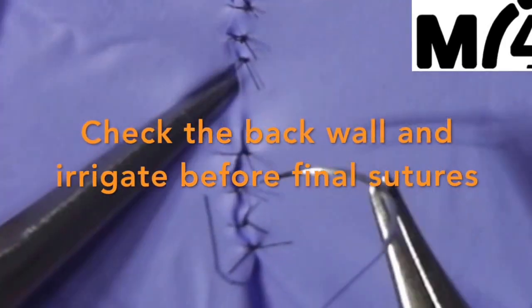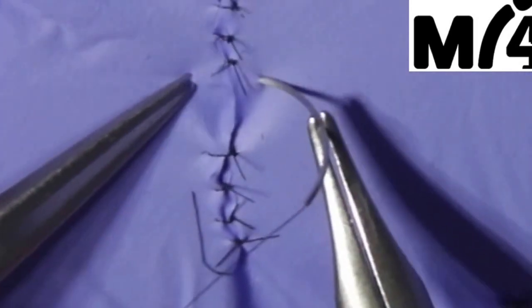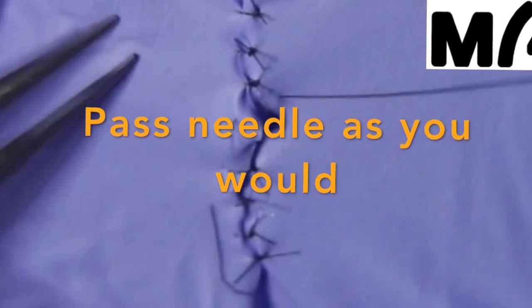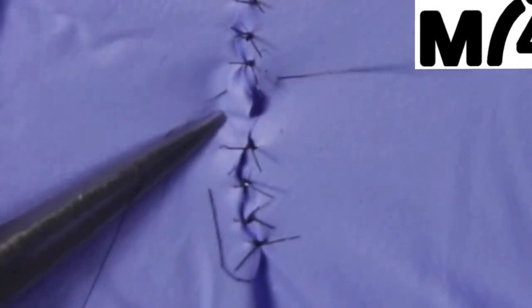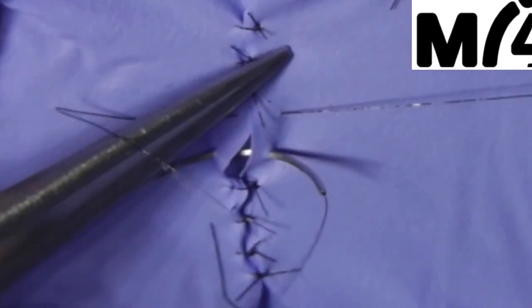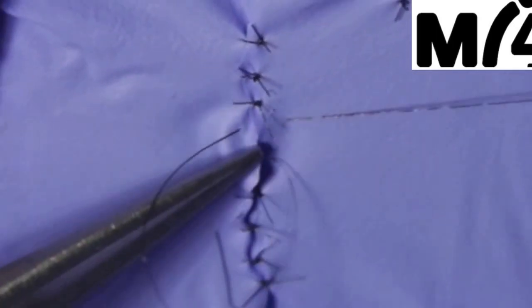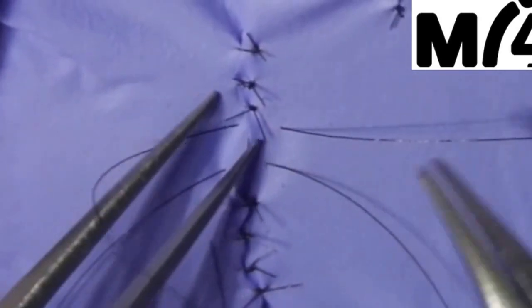Before I put my stitch in, I'm making sure I haven't caught the back wall and not handling the edge. So I pass the needle through, but I continue straight on to my second pass. Now because there's a big gap I was able to pass that needle through and I can now assess to see whether I've caught the back wall.